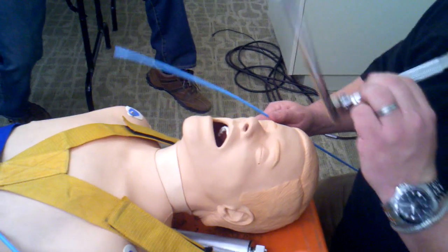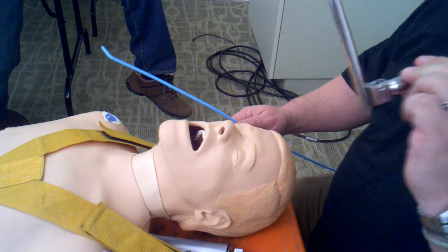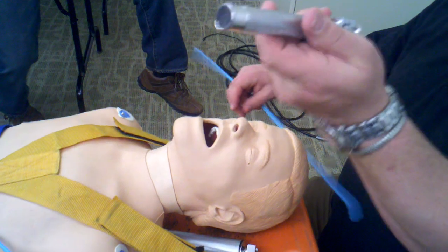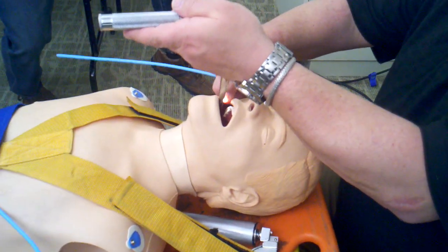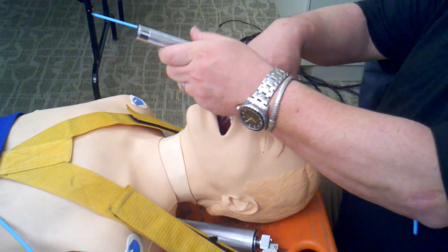Right molar technique for intubations with small mouth opening and large tongue. We need to make a straight line between the teeth and the glottic opening. Insert the Miller blade to the right side of the mouth following the lower molars, then follow the anatomy around until the blade starts to turn to the left on its own.